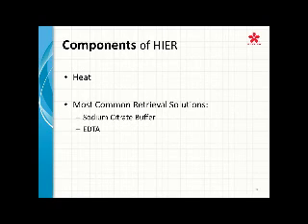Going through the process, you're always going to deparaffinize your slides, and then you're going to do your epitope retrieval, and we're talking about heat-induced epitope retrieval.